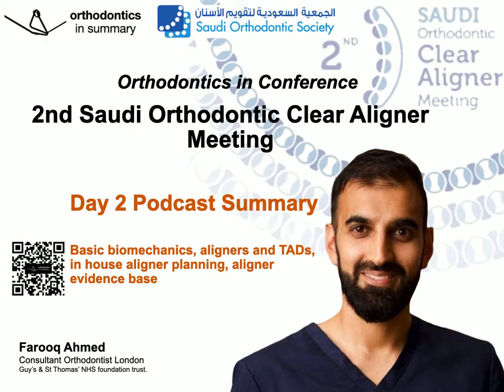Kim went on to describe how torque works with aligners. He mentioned that we need to have the greatest force for torque taking place at the cervical aspect of the aligner.